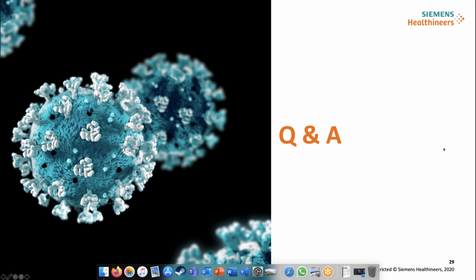This is not possible. But luckily, all the existing transducers that are already in the hospital, already on the machine, can do the job very well. So this is the good point, that there was no need to update the machine, no need to buy new things, etc. It's already most likely ready to do the job. So it's very easy and convenient to use the normal transducer.